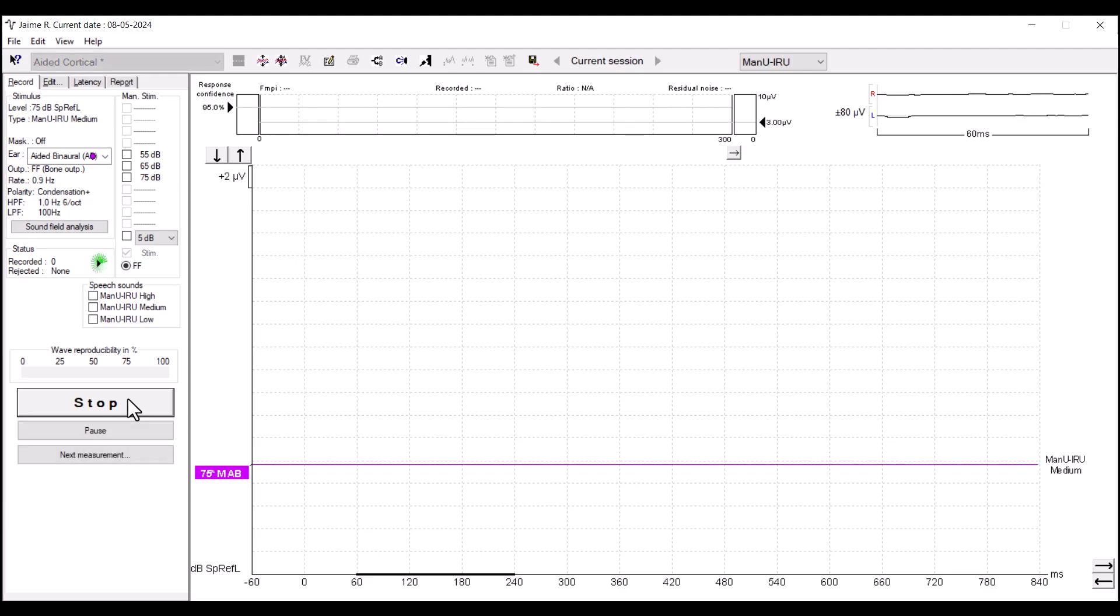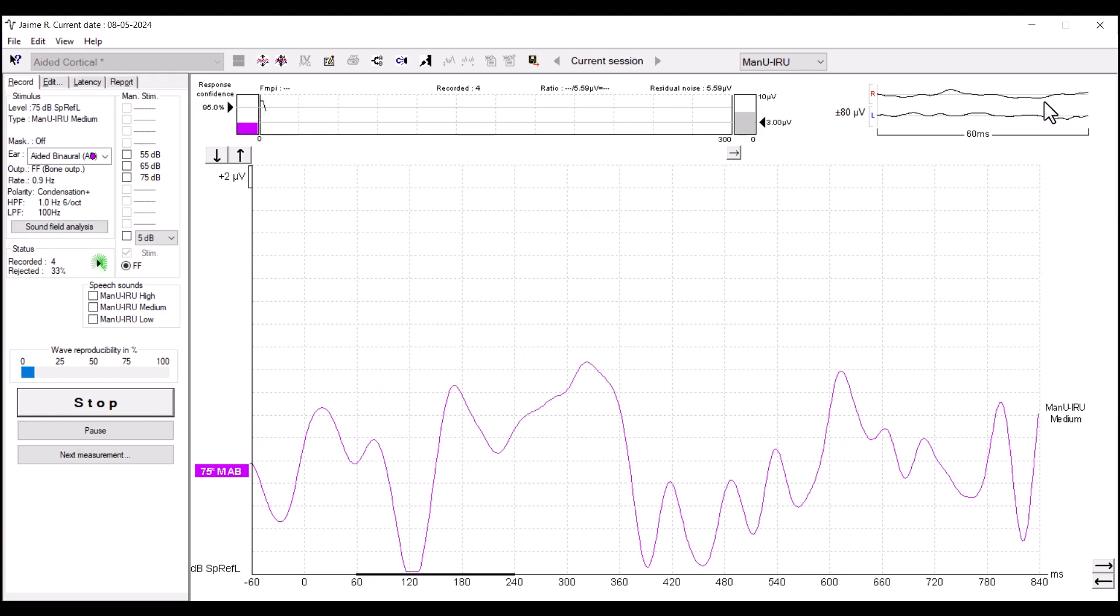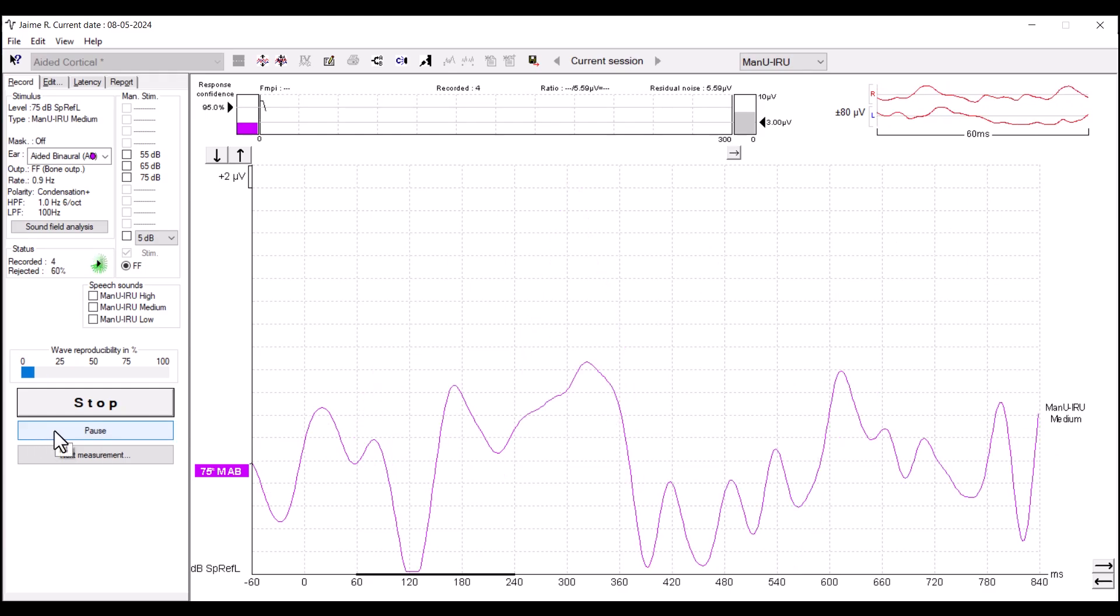Monitor the EEG graph and the patient to ensure they do not become too noisy during testing. You can press the pause button at any time to pause testing if you need to wait for the child to settle.